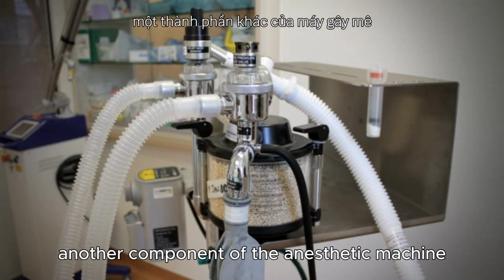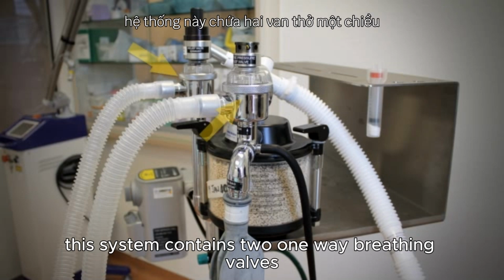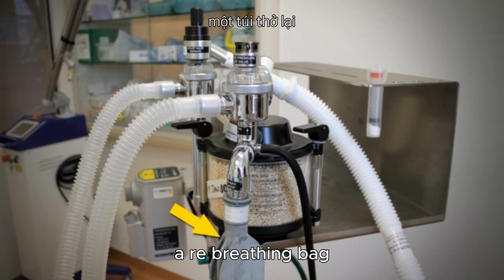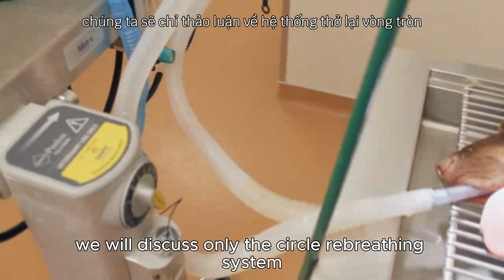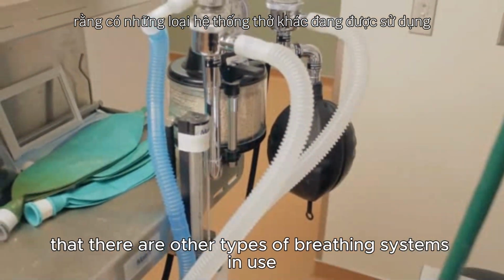Another component of the anesthetic machine is the breathing circuit. This system contains two one-way breathing valves, breathing tubes, a rebreathing bag, a pop-off valve, and carbon dioxide absorbing canister. We will discuss only the circle rebreathing system, but be aware that there are other types of breathing systems in use.